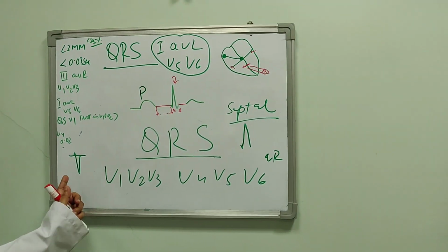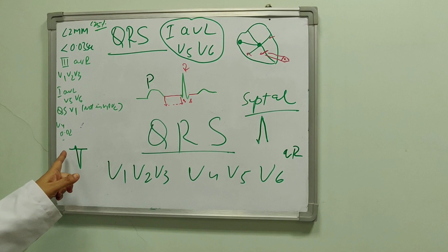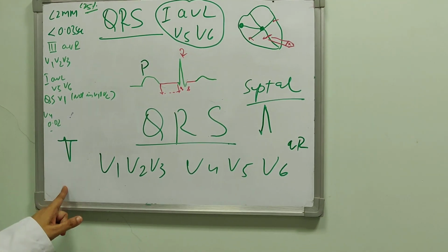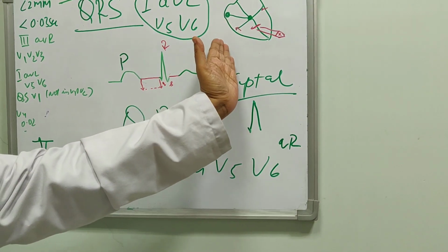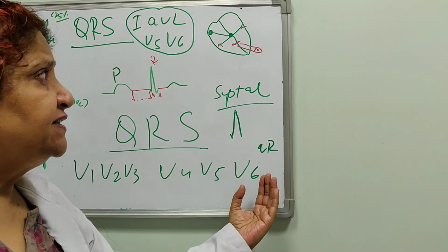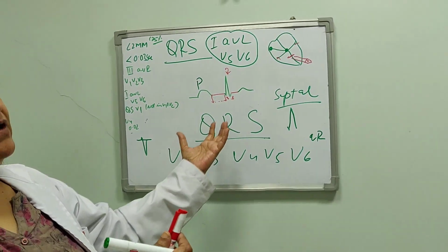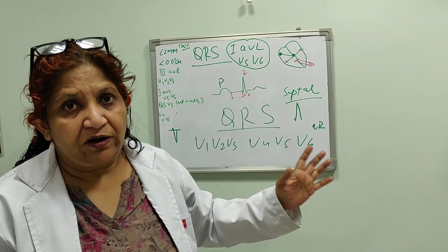Now the second part was the major ventricular depolarization, which is recorded by V1 as an S wave because that depolarization is down and left, which is away from the V1 lead. And when it comes to V4, V5, V6, it will sense as a positive deflection, so a tall R wave will be subtended.